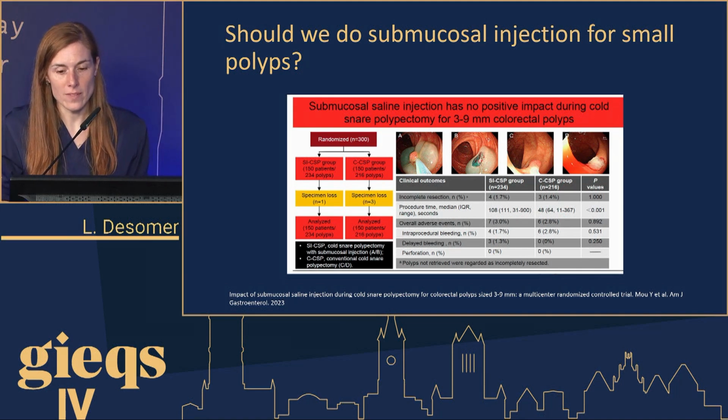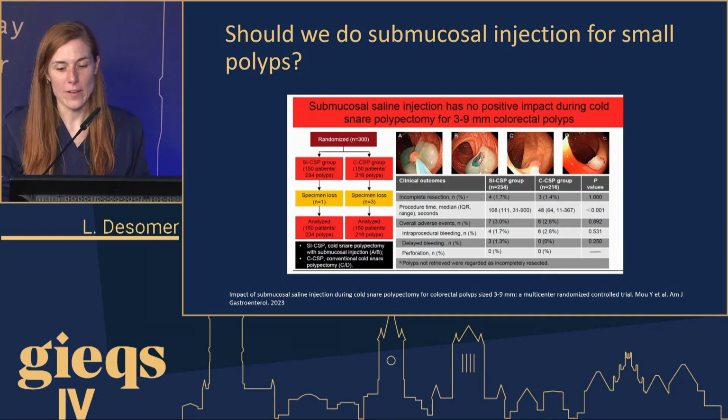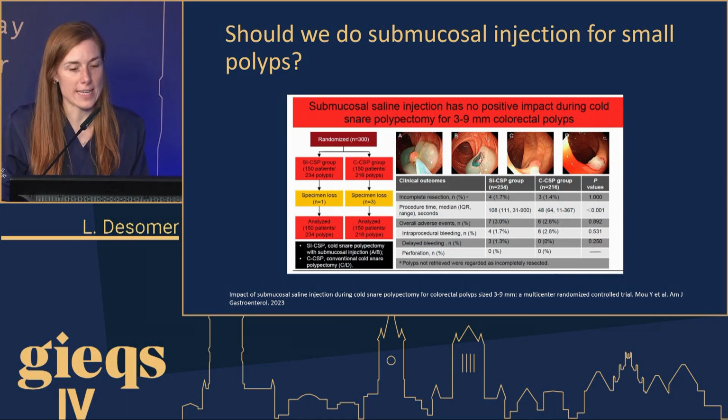So should we inject for small polyps? What's the impact of that? It doesn't really make a difference, only in procedure time, and that's the negative side of it. So for small polyps, we shouldn't really inject.